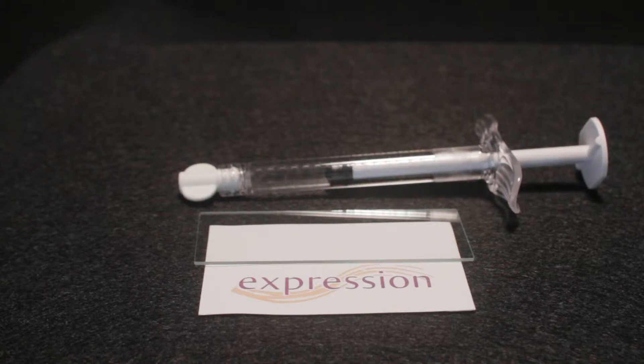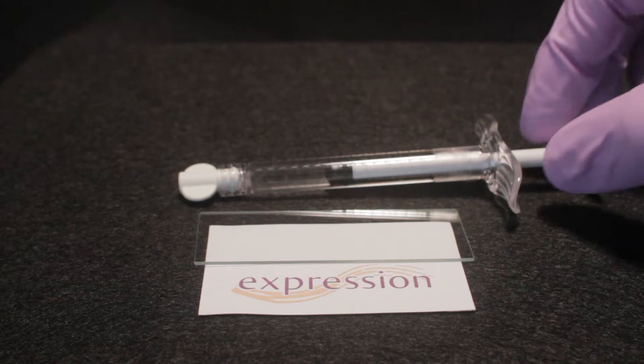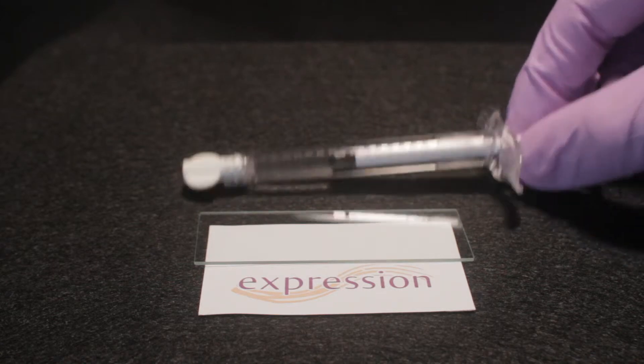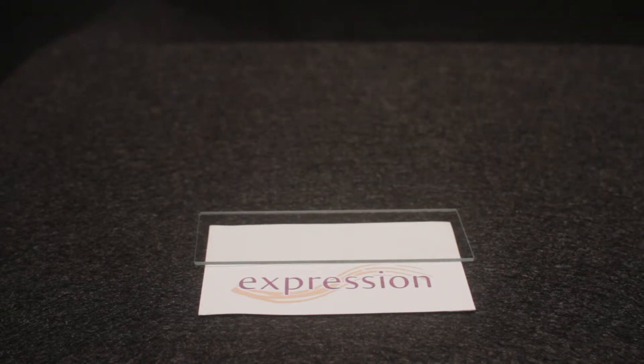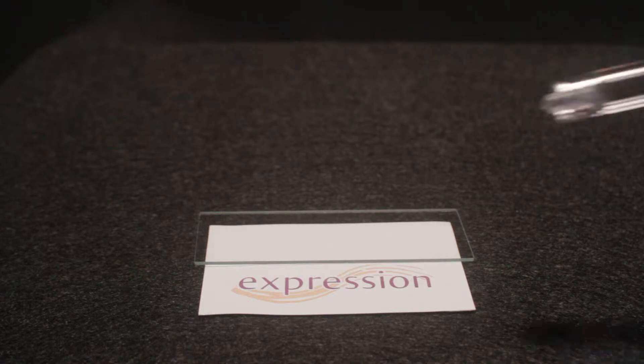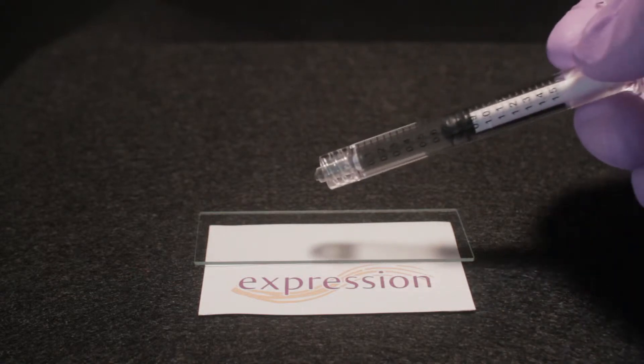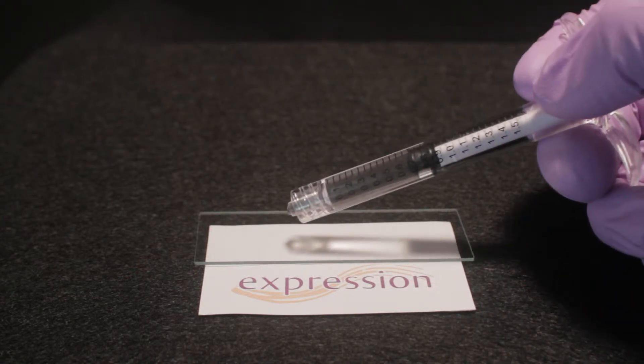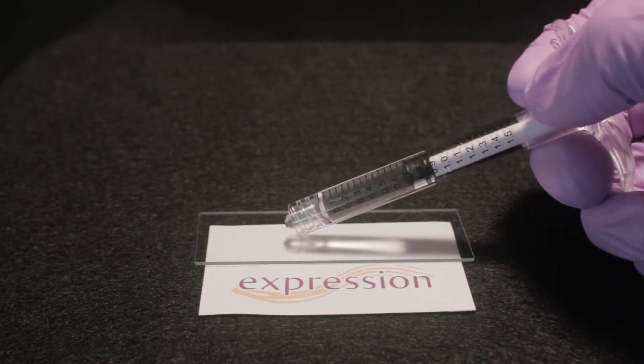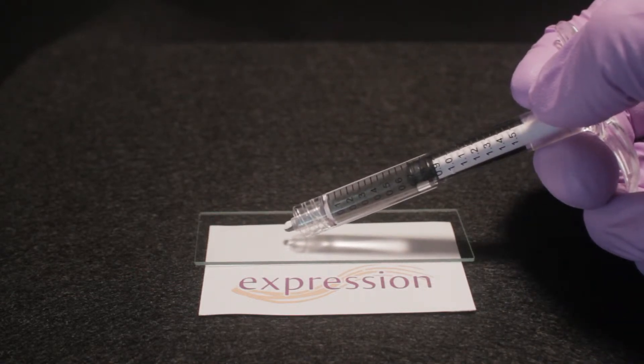Today we will be conducting an in vitro study of the effect of hyaluronidase on expression hyaluronic acid injectable gel in order to demonstrate the potential for reversibility. Reversibility is one of the most important hyaluronic acid characteristics.